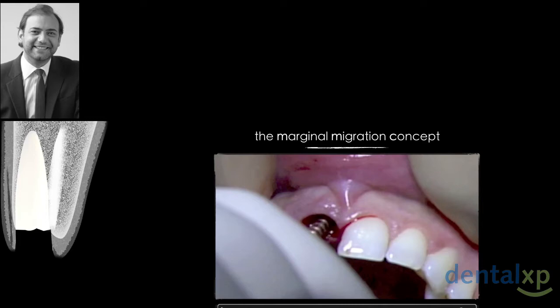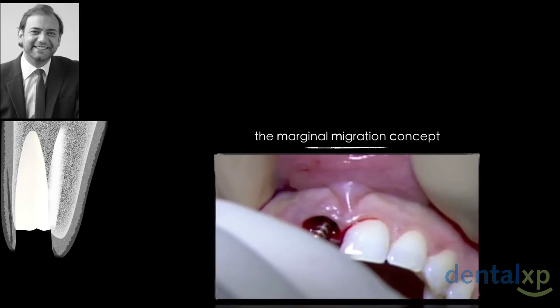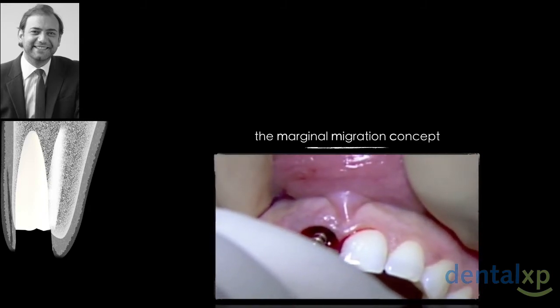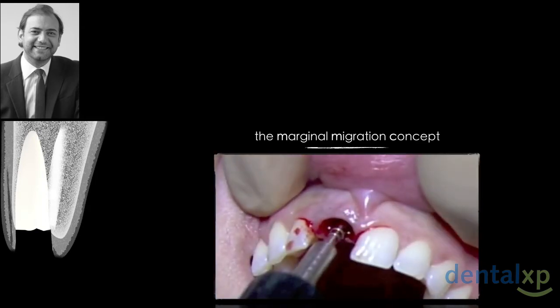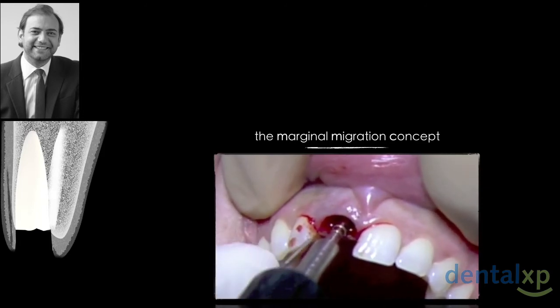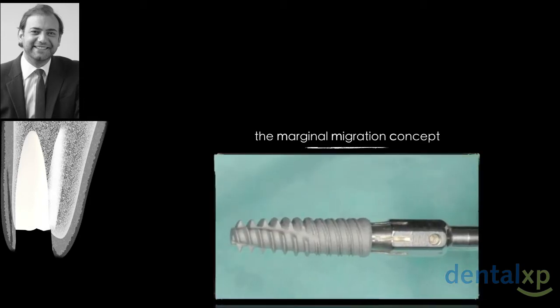So the only time I'm stressed is with my pilot drill. I need to be exact, and then I have a huge device which will point out if my direction is wrong. No water, a very slow device, which really makes me feel safe. So, as you see here on the right side, we stop, we check the depth, the inclination, the direction of the implant, as we heard over the last lectures, is so important.